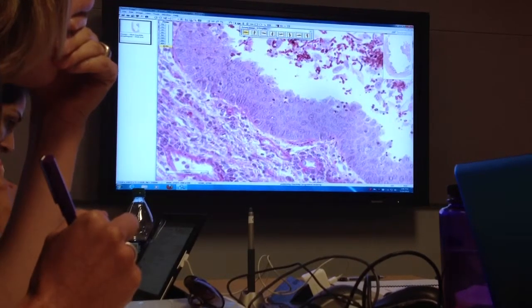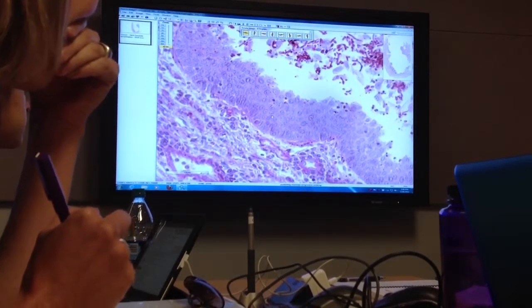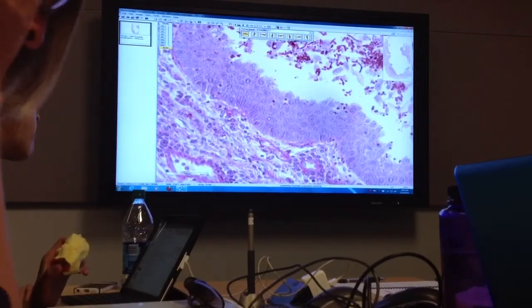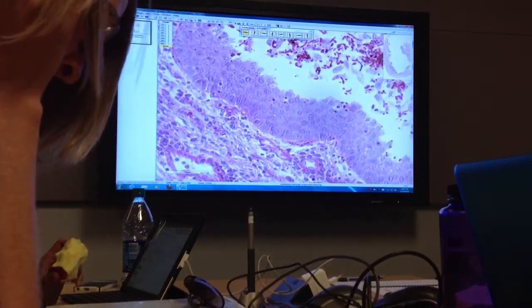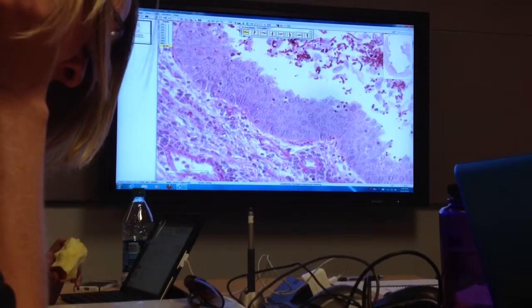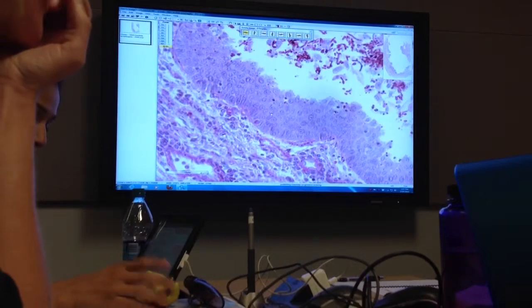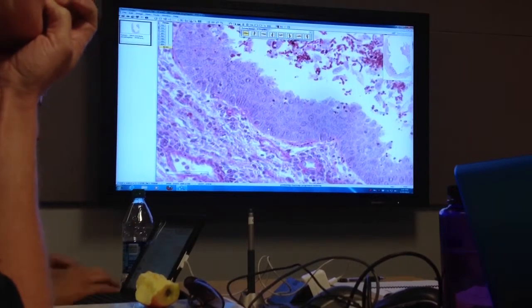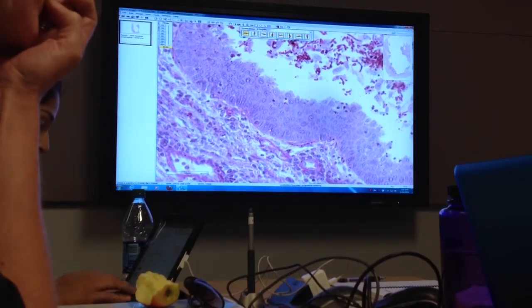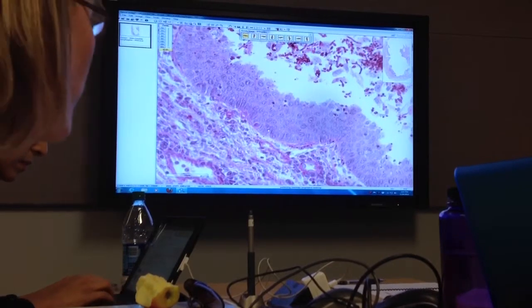And see how they're kind of the same, the nuclei, they're very smooth and round, and they look like each other. Each guy looks like his neighbor. And then see how there's lots of good space in between them. They still have plenty of cytoplasm. So when you become dysplastic, you get really hyperchromatic, dark, and you get bigger, you get irregular, and you start overlapping your neighbor, and you lose cytoplasm. Your nuclear to cytoplasmic ratio increases.